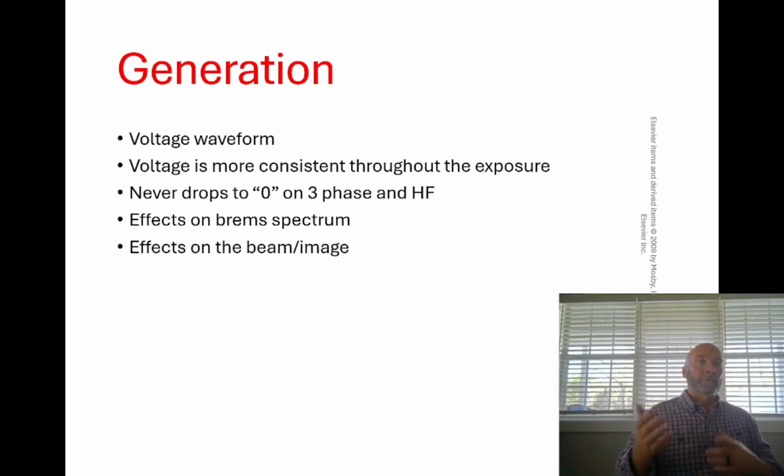Then let's say we need to repeat, it's a good technique, but we need to repeat in a three-phase room. What we're going to do is move the patient to the three-phase room. We're going to divide our mAs by 2, and now we need 16 mAs. So if we go from single-phase to three-phase, we divide by 2. If we go from three-phase to single-phase, we multiply by 2.